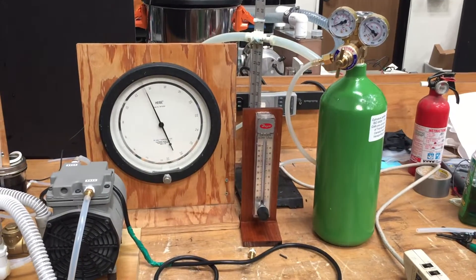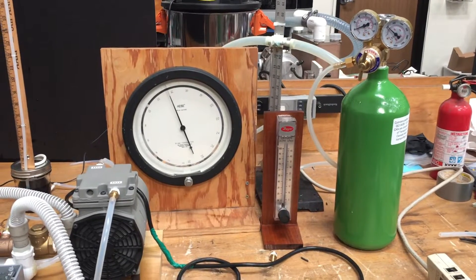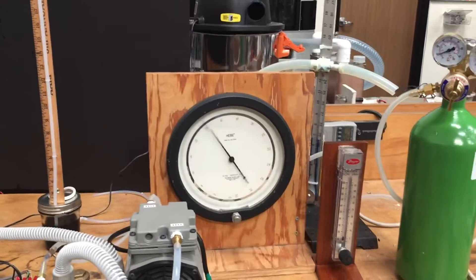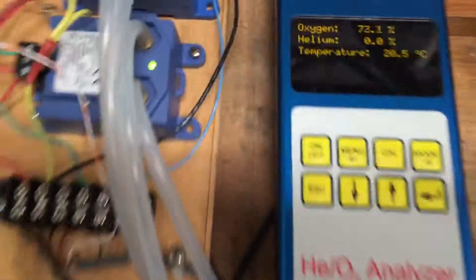This is a rudimentary ventilator made of parts you can buy at Home Depot or Harbor Freight. This is the oxygen system. We're running at about 70% oxygen.